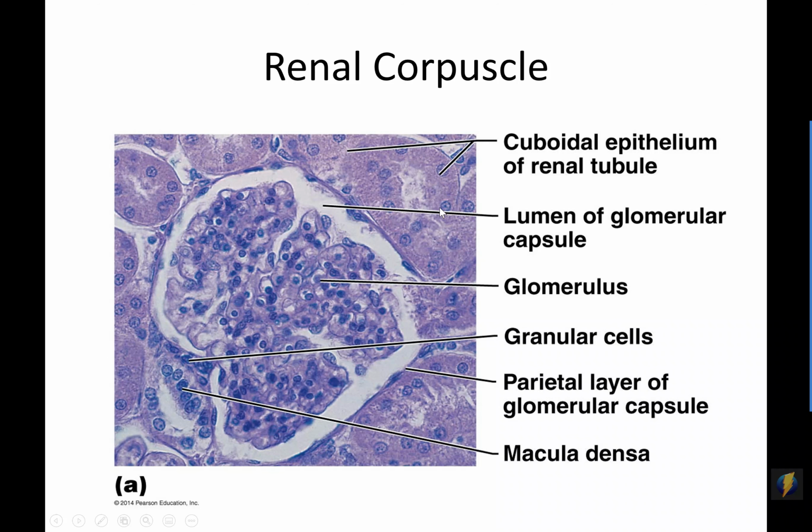One thing to note about the renal tubules, it's what you see in cross-section surrounding the renal corpuscle. If the lumen of the tubule looks kind of fuzzy, like these two here, those are likely to be cross-sections of the proximal convoluted tubule. The proximal convoluted tubule has lots of little microvilli, little finger-like projections that create more surface area for reabsorption, and so the lumen appears much fuzzier. Whereas if you have a lumen that's much clearer looking, then you're likely looking at either part of the nephron loop or the distal convoluted tubule, because they don't have as many microvilli.